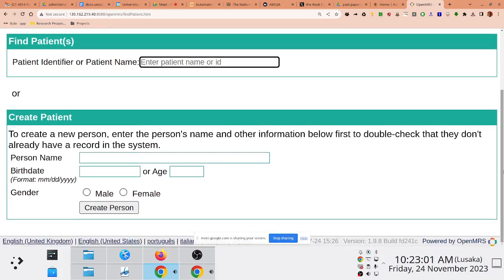In the case where the referring physician wants to attach a radiology order, they can go on and do that. But we'll begin with the first feature, actually creating a patient who does not exist if they come in for the first time. I'll pick Philip here.